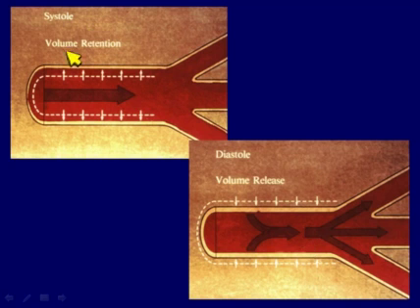That little bit of antegrade flow is the result of the fact that in systole the vessels expand. They're nice and compliant and elastic, and that expansion actually holds a volume of blood out near the wall. And we can see that expansion when we watch the pulsatility occur in vessels. In diastole, when the pressure decreases, the walls contract back, again due to that elastic recoil. A volume of blood that's held out there gets propelled downstream, and that gives us that third antegrade component.